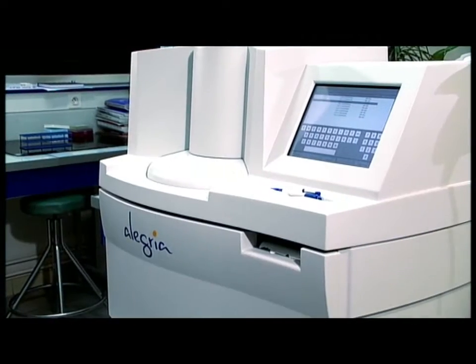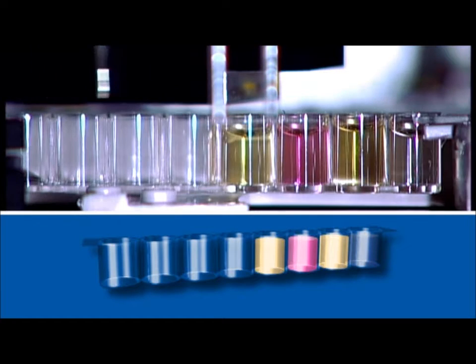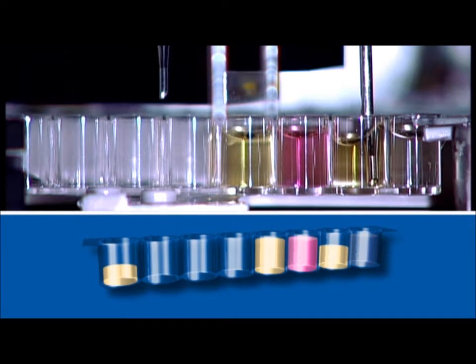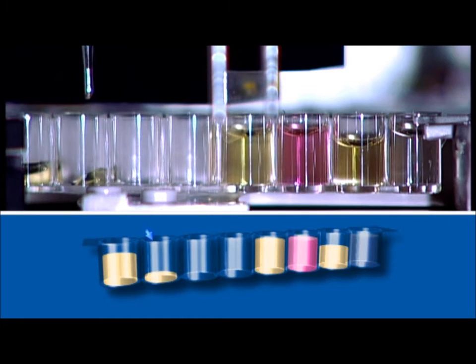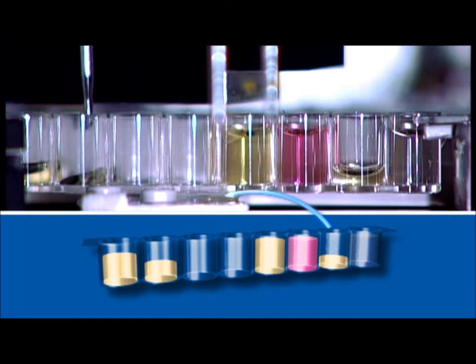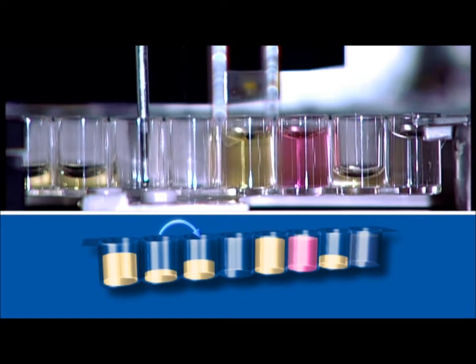While the unit is testing the samples, the unique way in which it works will be explained with these charts. A testing process consists of 10 steps. The first step for Allegria is to dilute the sample. In the second step, Allegria pipettes the sample into the coated sample cavity.